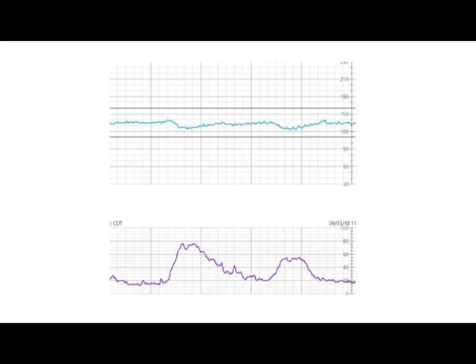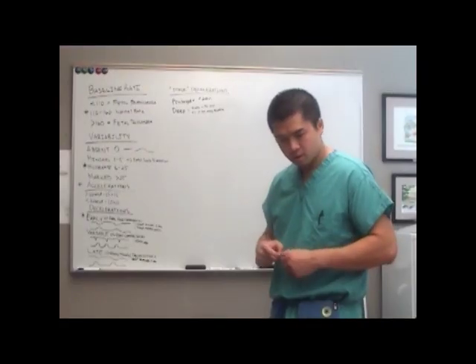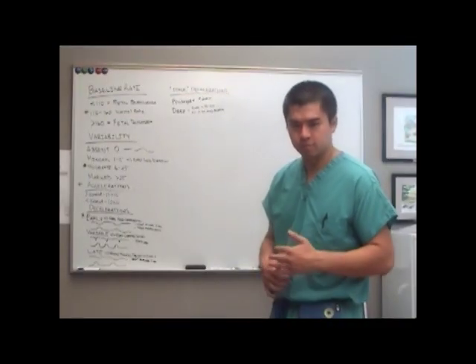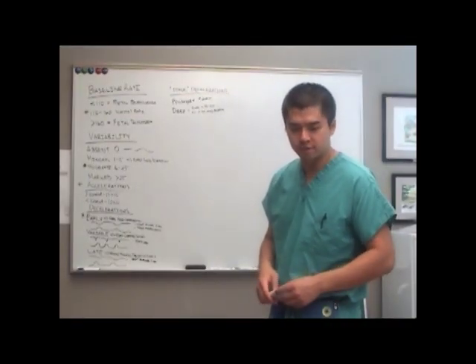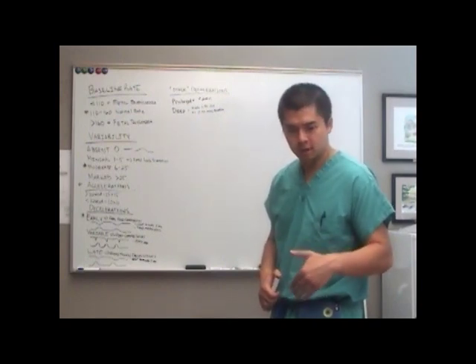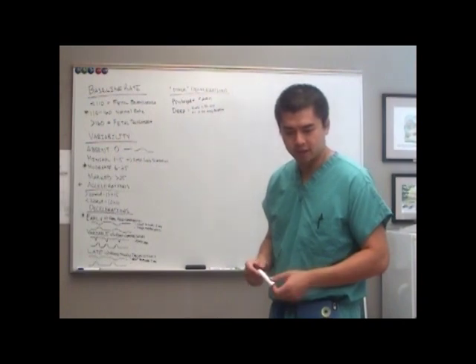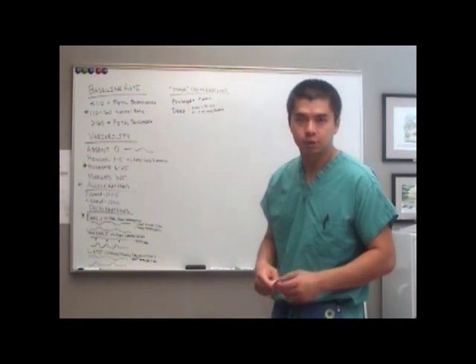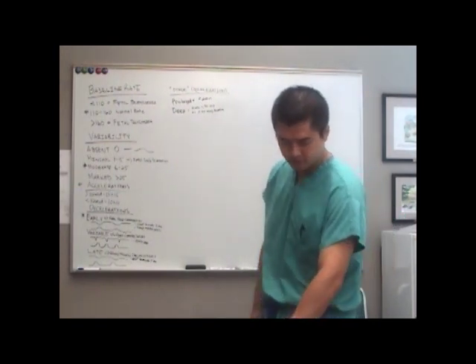In this first example, what type of deceleration is here? Yeah, it's an early deceleration. And so is this deceleration dropping enough to meet the definition of an early? That's correct. It's dropping below the baseline period. There's no definition for how far it needs to drop. So it's gradual. It goes down to the trough in greater than 30 seconds, and the trough matches the peak of the contraction. So it meets the definition of an early. And what does this do to?